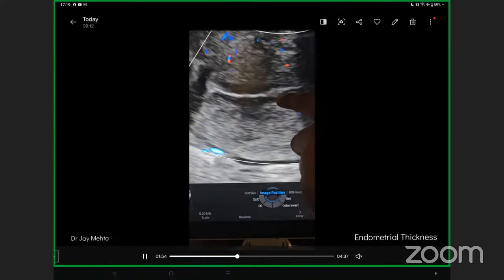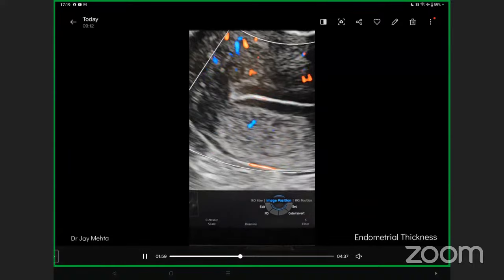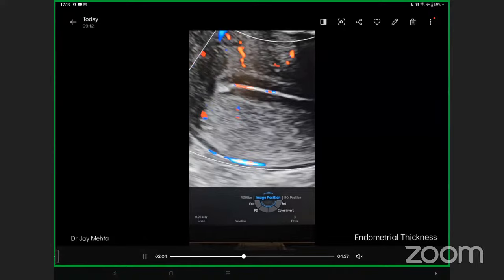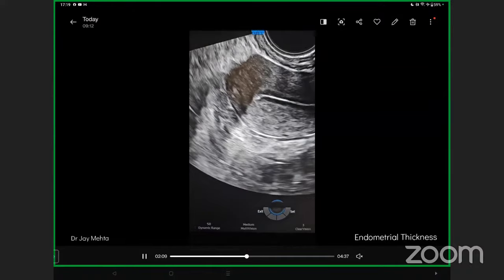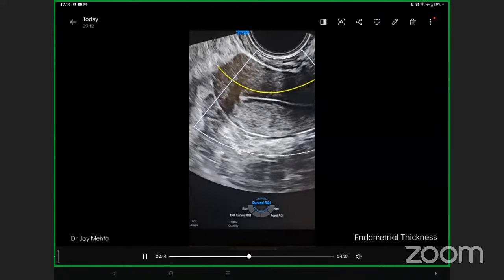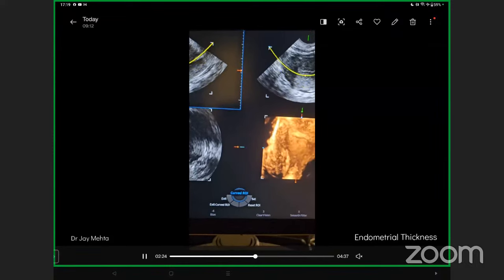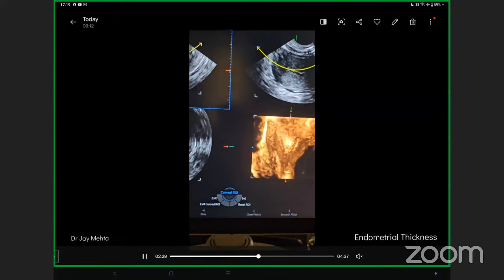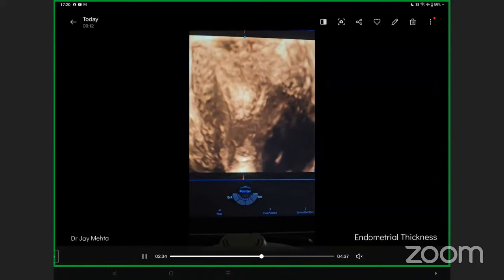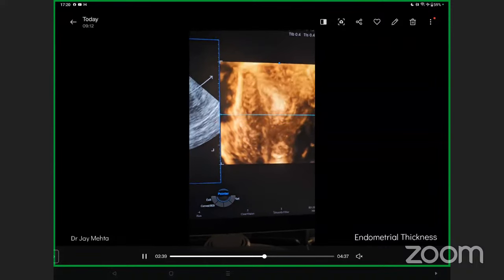Because this is not a 3D picture, vascularity might not be coming in on that particular plane but may be present in a separate plane you haven't picked up. So a 3D assessment with Doppler is also something to be done. Before doing that, we take a 3D stripe of the endometrium — you can see the acquisition has been done and once acquired you can see the whole cavity from one corner to the other corner by just swiping the region of interest.